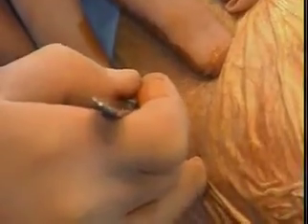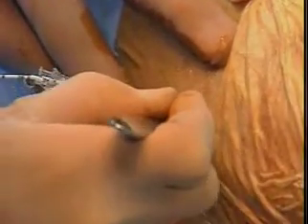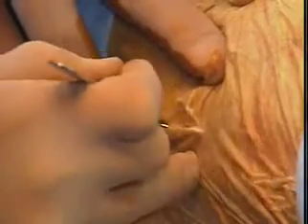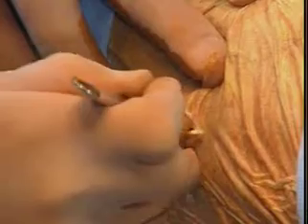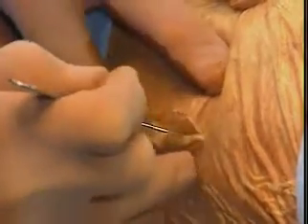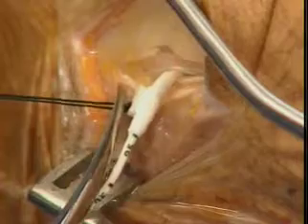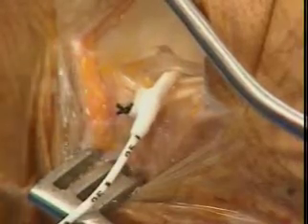Performing the implant procedure through an incision that is too small can also lead to these complications. An incision at least 5 centimeters long is usually required to accommodate the anchoring hardware. Once the incision is made, it is important to undermine the edges to develop a smooth fascial plane for the anchoring hardware and to permit gentle bends in the catheter. This procedure also allows the anchor and catheter to remain properly positioned when the incision is closed.